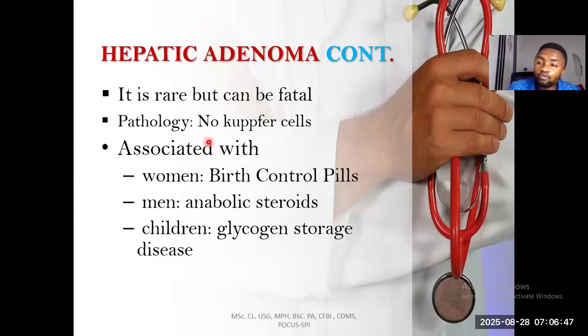So when you are able to tell that this is a liver lesion which looks like adenoma, the doctor will request, or you can request at the end of your report, a recommendation for what? Histopathology. What is histopathology? It means they send the patient to a specialist who deals with picking structures from the body and viewing them under the microscope and telling us whether this is cancer or not, or this is this particular mass. They are able to tell every mass when they take part of the tissue from the mass and send it to the lab. Do you understand?